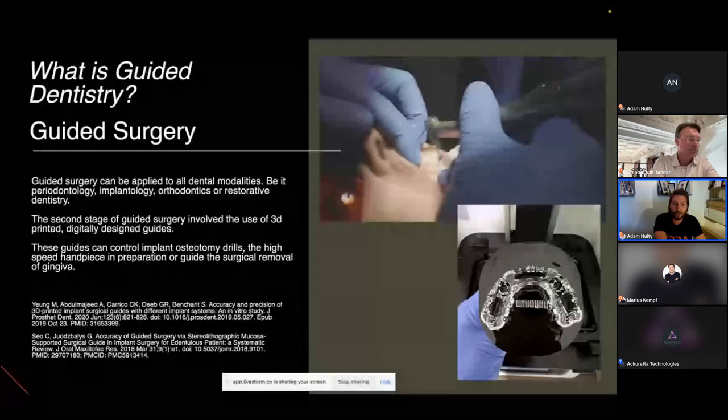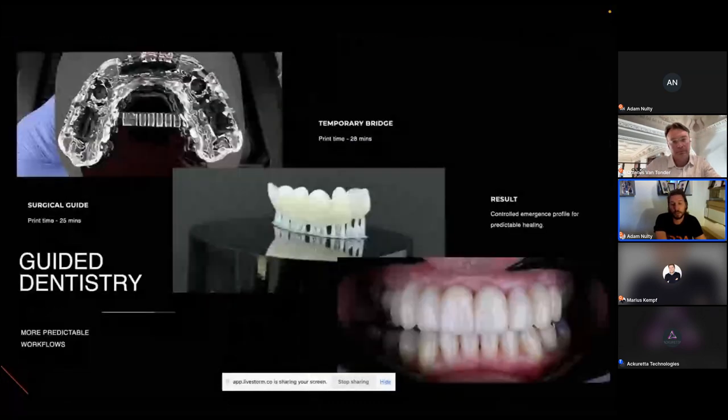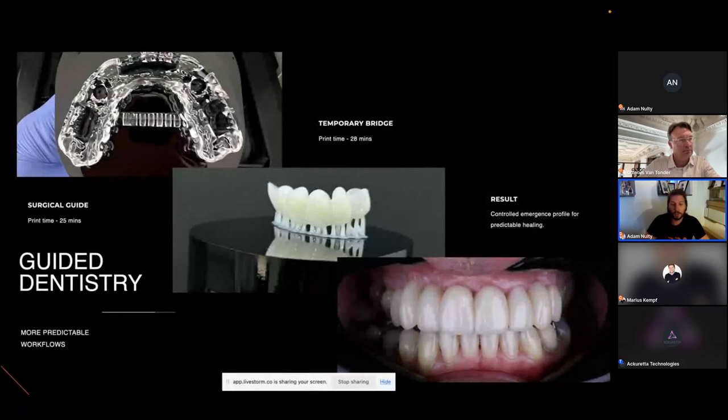So guided dentistry is really the whole process of making sure that we can increase the accuracy of everything that we do and plan ahead, rather than trying to treat something, but thinking about the end result at every stage, no matter whether it's implants, restorative, perio, you name it. We plan ahead and then use the technology as a tool to make sure that that plan comes to effect in a streamlined and predictable manner.